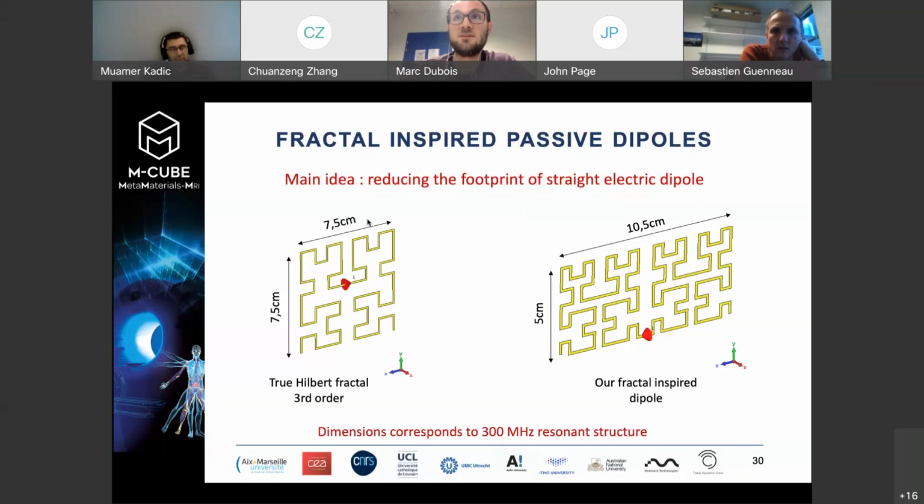And it's due to a specific part. I didn't go into details, but when you do images, you need to make the B0 change from time to time, just with on, off like this. You have a signal that's almost like a TTL, a square signal. Every time you have a ramp, either up or down, you have a coil with a magnet, and you switch the current inside, and it's the Lorentz force, I think people call it. And so what you hear is, when you switch this voltage on and off, or -1, +1, the system just goes clack, clack, clack, changing a little bit.